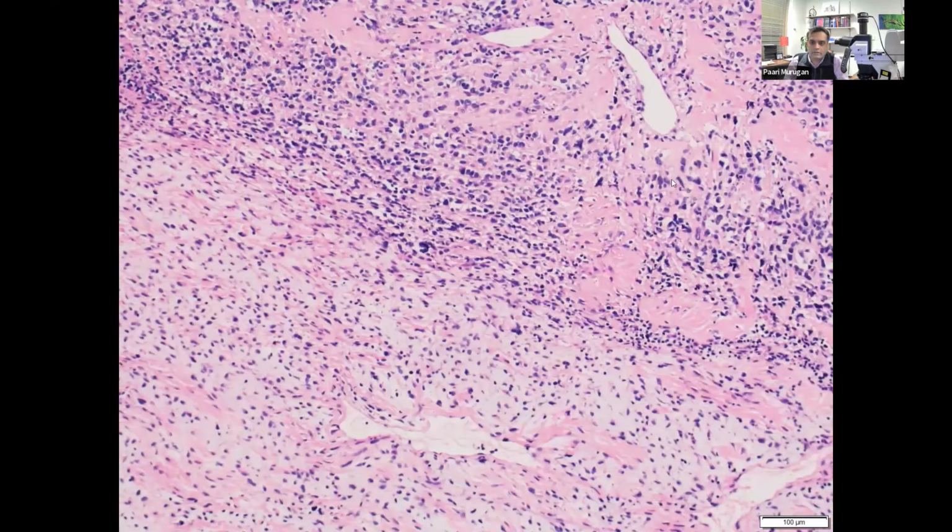And then finally, I just wanted to show you that these are all occurring in the same tumor. So here is a zone of transition between the hypocellular or moderately cellular myxoid fibrous areas with the spindle cells and more hypercellular areas with the epithelioid or rounded cells that are growing or infiltrating in a sclerotic background. So with this appearance, of course, we want to think of some differential diagnosis. And this is a mind-boggling differential diagnosis because you saw the heterogeneity in the morphology.